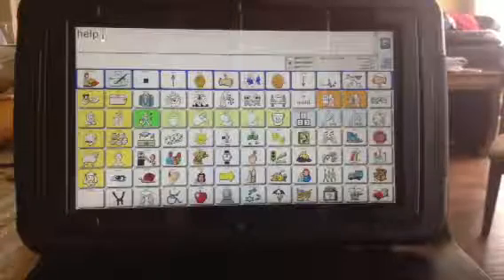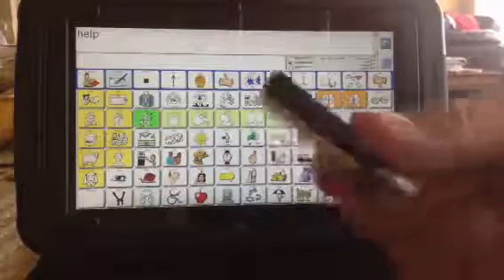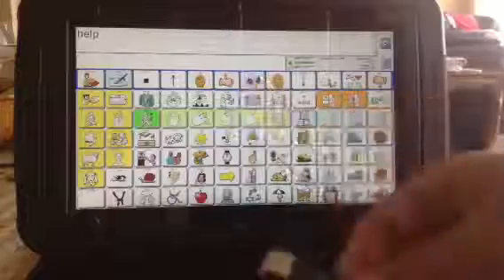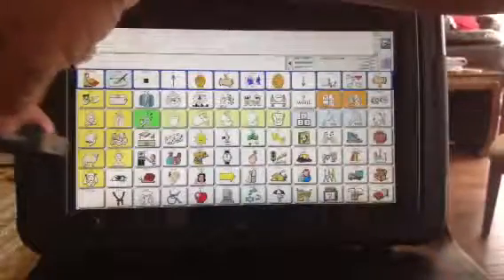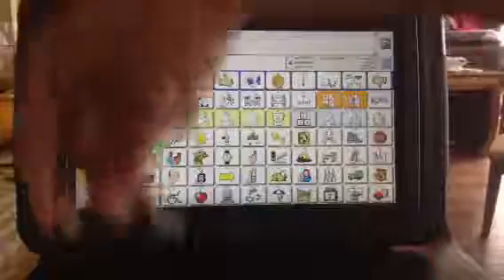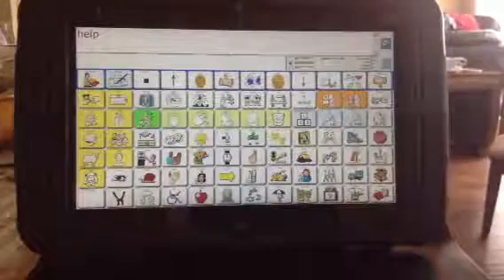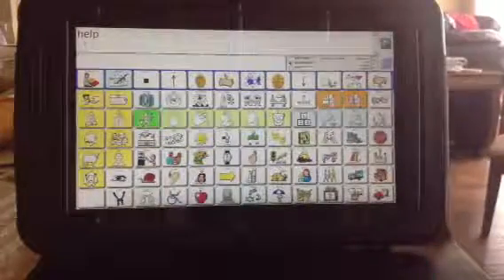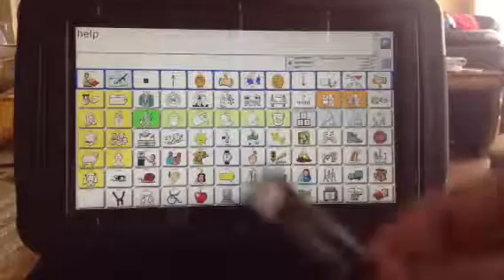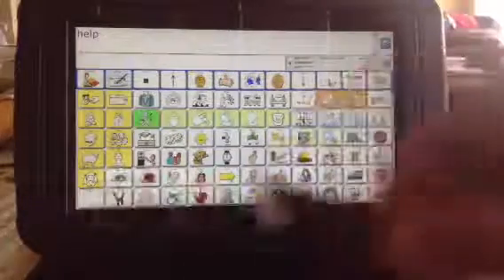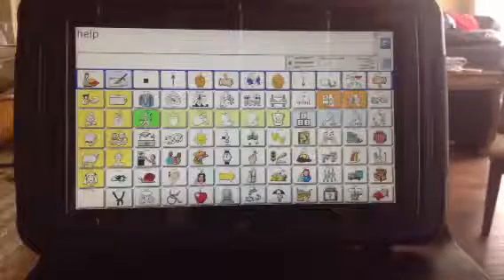The next thing we're going to talk about is backing up your vocabulary onto one of these USB jump drives. Take any jump drive you have and reach around the back — on the left-hand side on the bottom, you'll slide that jump drive in. I already have one in there. So you could do it at the beginning or in the middle, but right now I already have a jump drive in. Now let's learn how to save your vocabulary.